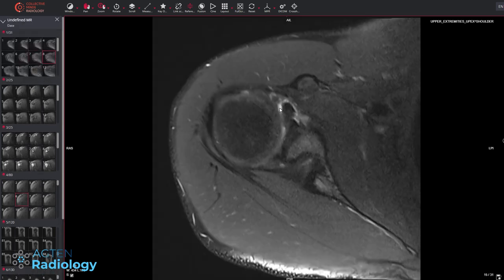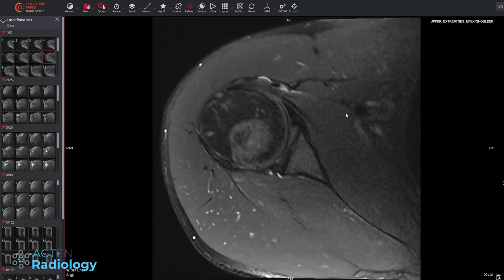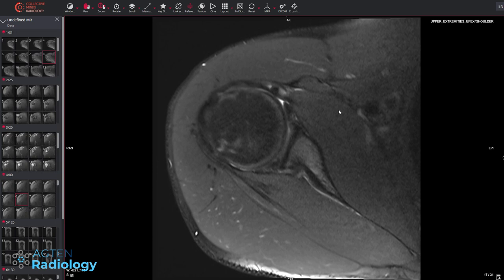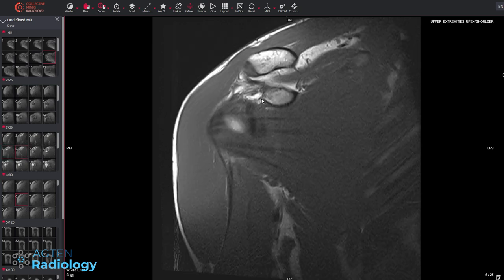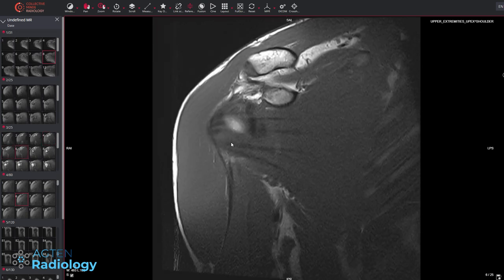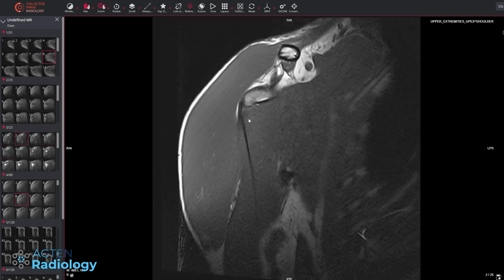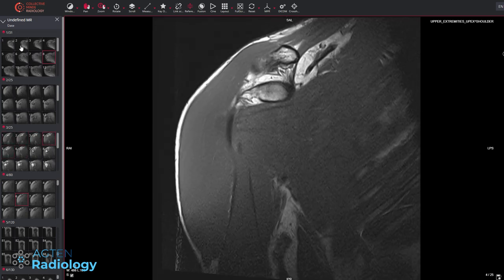Also check the deltoid muscle — no strain, nothing. Very strong musculature. Moving to the rotator interval: the fat is preserved, nothing like frozen shoulder, and the ligaments look very smooth. Now we see a structure here which we can correlate with the transverse section. It's at a weird position because it's not the long head of the biceps tendon — that's this one here. So we have an additional slip or tendon there.